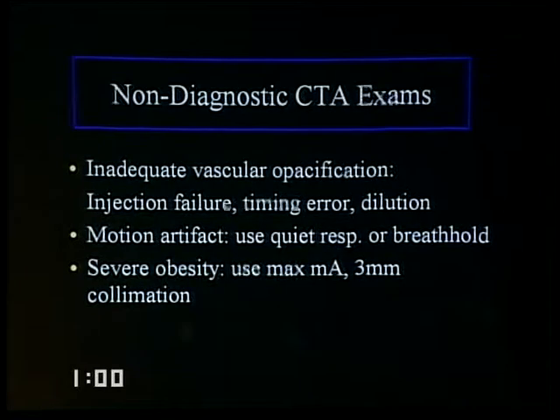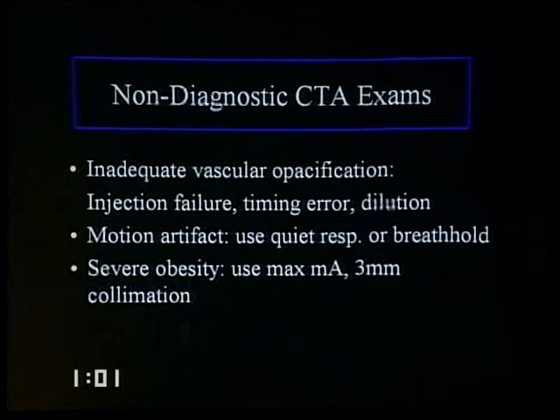What to do about non-diagnostic exams? There are a number of causes for this. Obesity is a constant problem. We use maximum mA, and sometimes in the past I've used thicker collimation. I'm not sure that this is worth doing. I still have this slide, and some people recommended this, but although it reduces noise, I'm not certain it makes the exam more diagnostic.